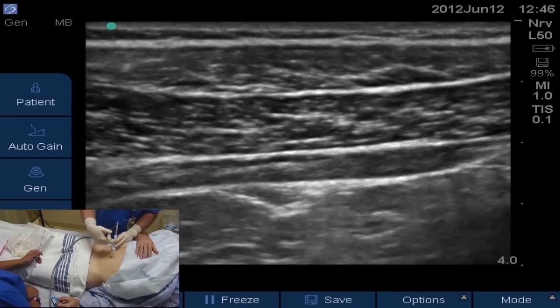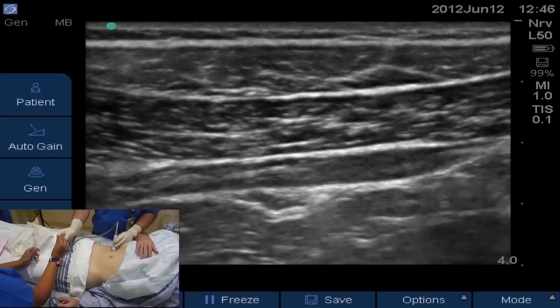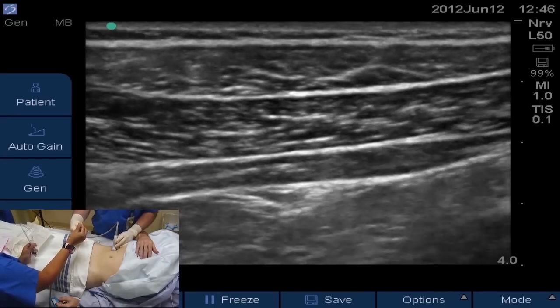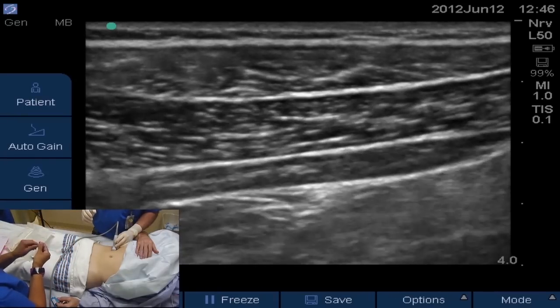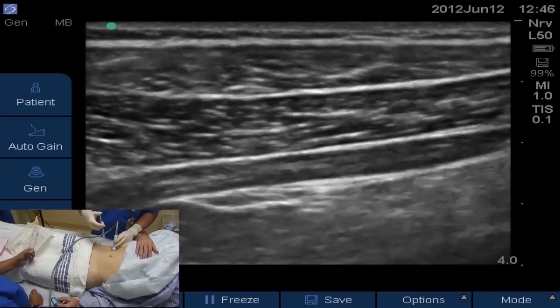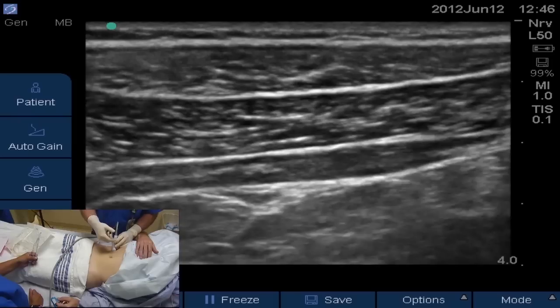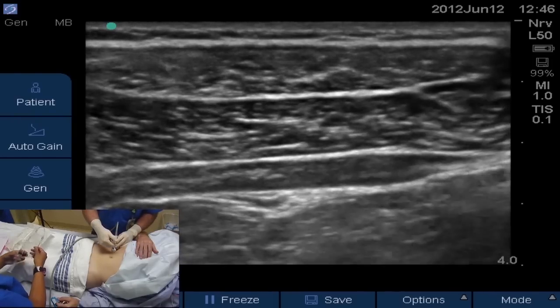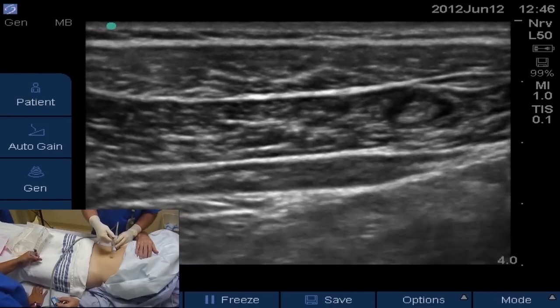So we're putting our local in. I have the probe in the anterior axillary line and we're going to work from medial to lateral. This is one block where you can go medial to lateral, or you can bring your needle in from the lateral side of the probe and come back medially. The key is ending up with most of your volume back at the lateral aspect — the posterior-lateral end of the muscle. You can see our local infiltration coming in from the right side of the screen.